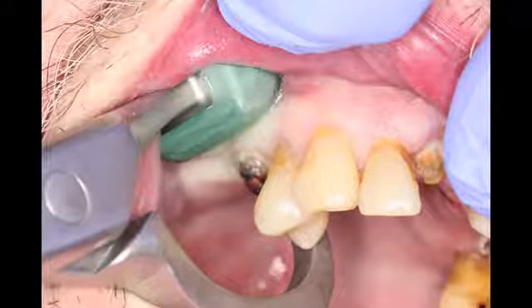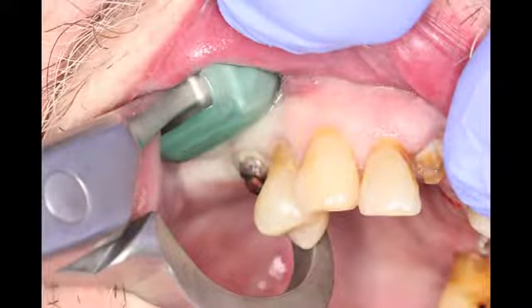It's a physiologic response. Once the periodontal ligament is removed, the tooth will come up and out of the socket very atraumatically. The second part of the instrument is what's referred to as a bumper, and that acts as a fulcrum. We place it as high up the vestibule as possible. There's a little silicone cover for it, but it doesn't really do anything as far as the extraction process. Again, it's just a fulcrum.